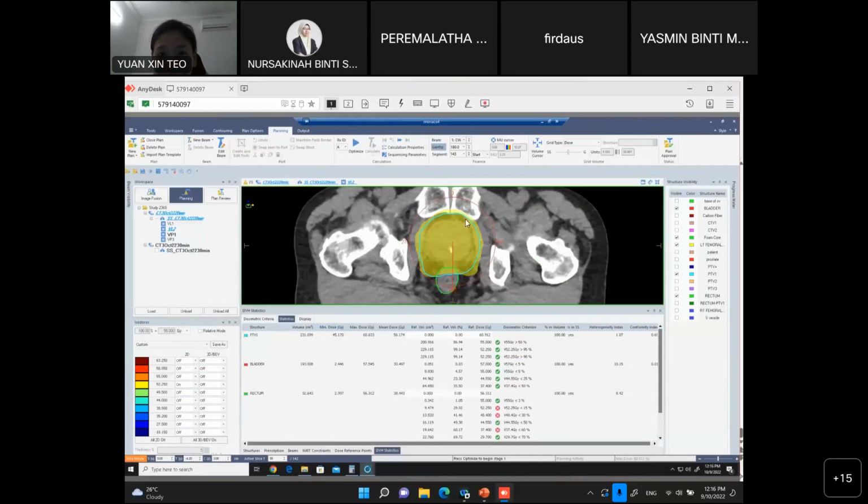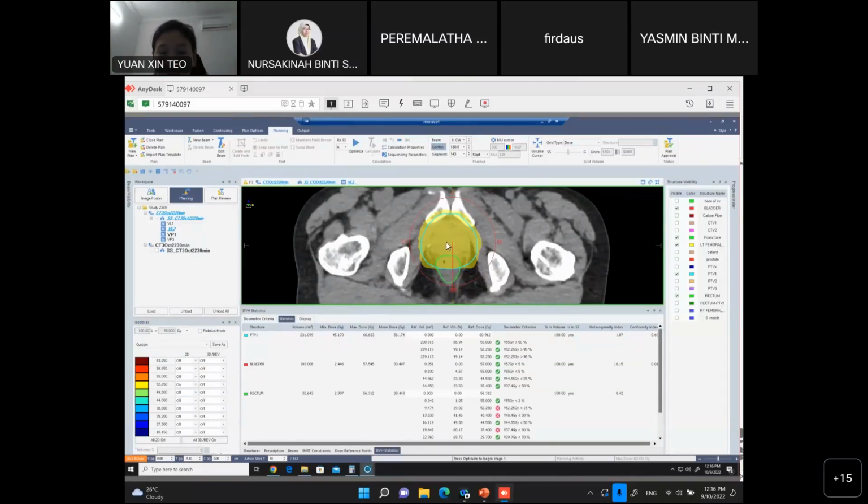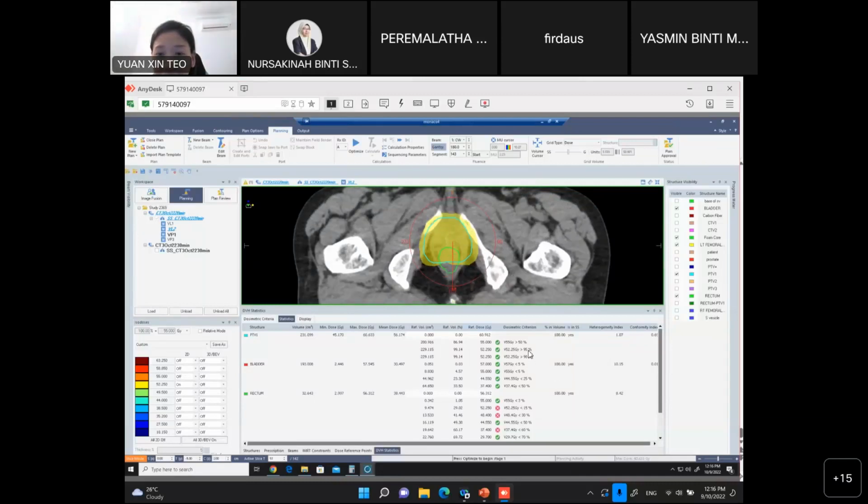Okay. So all the PTV receive at least 52.25 gray with the volume at least 95%. Okay, let's go to the bladder.